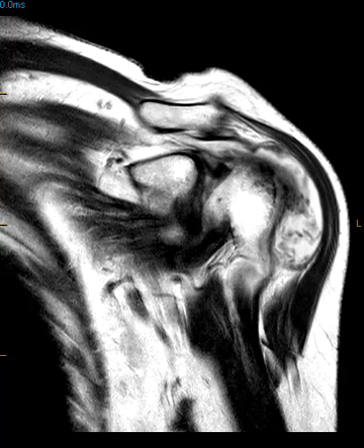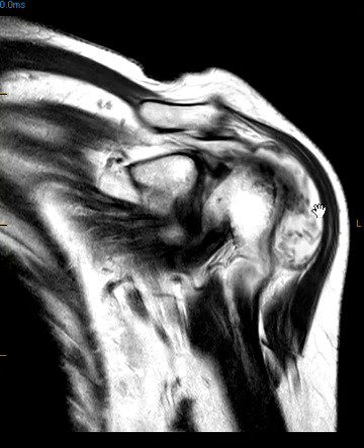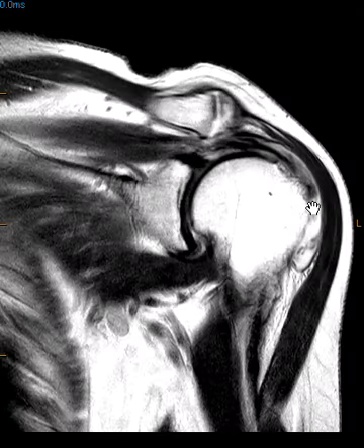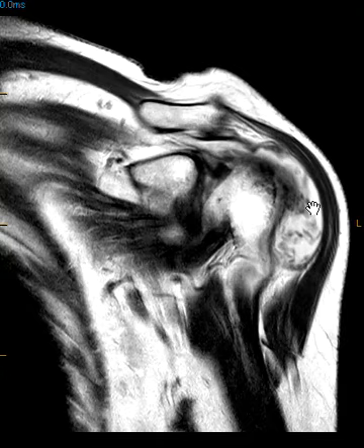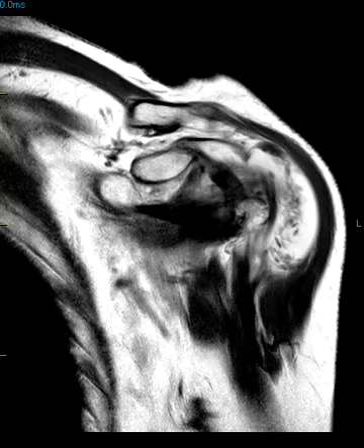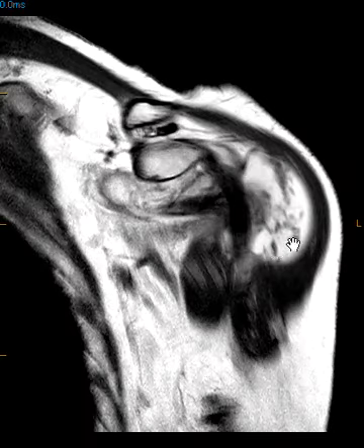Hello, this is Dr. Gay from FirstLake MRI. This is a 66-year-old female with shoulder pain, and this is an example of a large subacromial subdeltoid bursal effusion with multiple nodular synovial inflammatory changes.